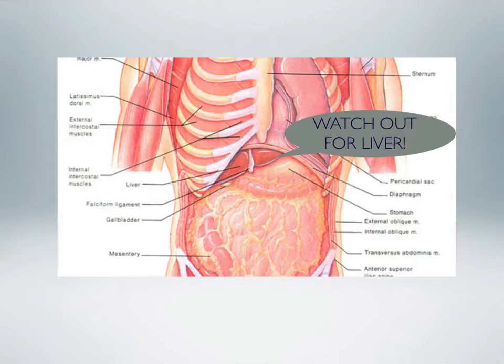For me, I prefer to go parasternal in one particular circumstance, and that's where there is no backup, or perhaps another circumstance where I'm worried about bleeding. So backup is typically available in U.S. hospitals. We're not in Tamale, Africa.